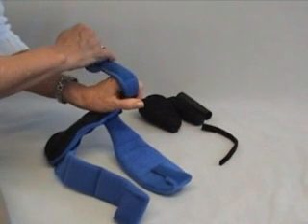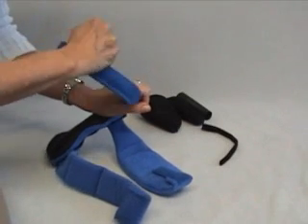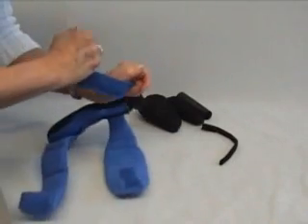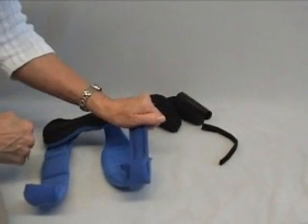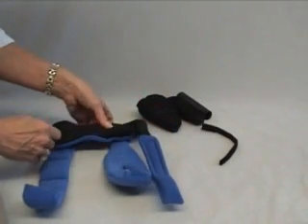Then gradually you should be able to, over a period of time, work it around. Sometimes fingers will be so tightly closed that you may want to fit it just on several and then just leave the material out. The slower the better — these people have been hurt so many times. They're very, very tender and they're actually frightened.